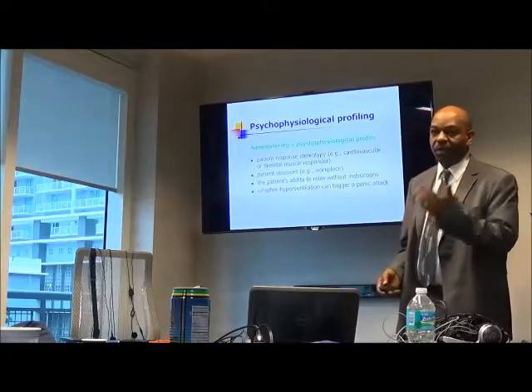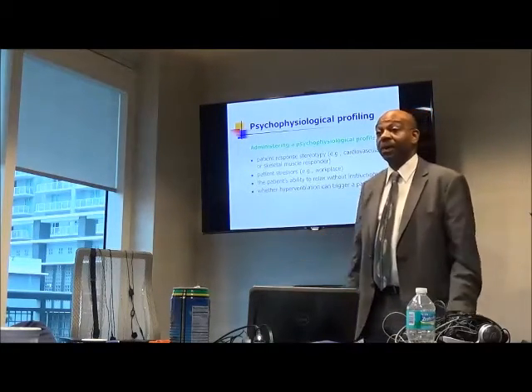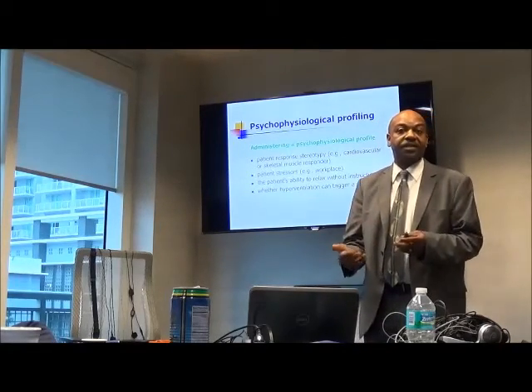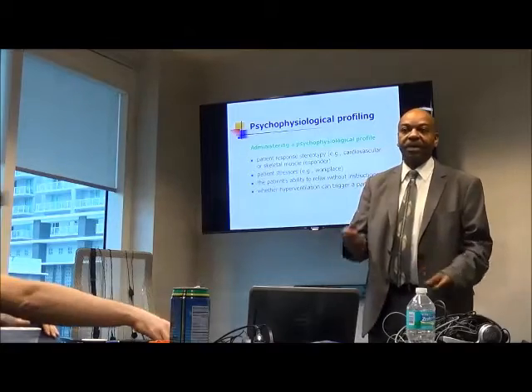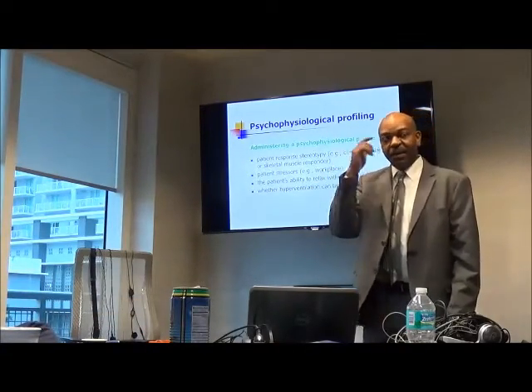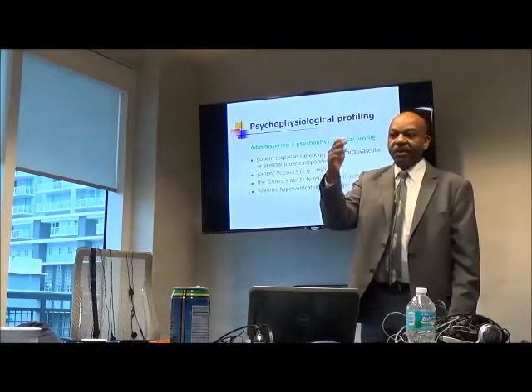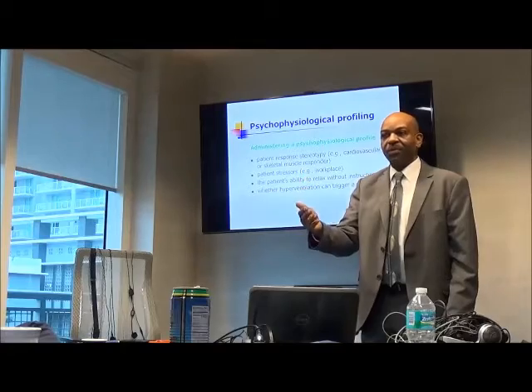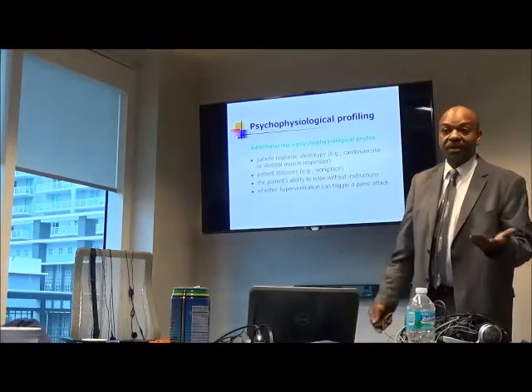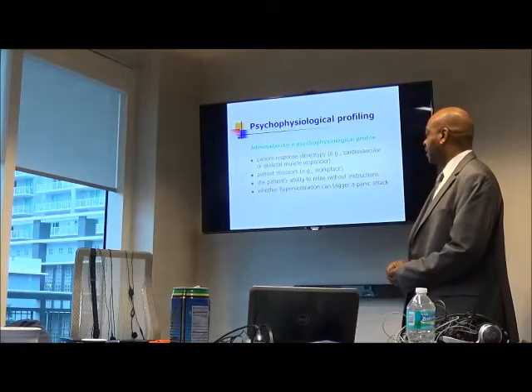And also, again, going back to a person just looking at the screen and not knowing what's going on, if they have that from the beginning, there's a much better chance that they're going to understand why they're doing it. And even looking for, while they're doing the session, okay, I remember when I did the test, my skin conductance was very high, and now as I'm doing my relaxation, I see it changing in the direction that they told me it needs to change in. So those are many things that I look for.